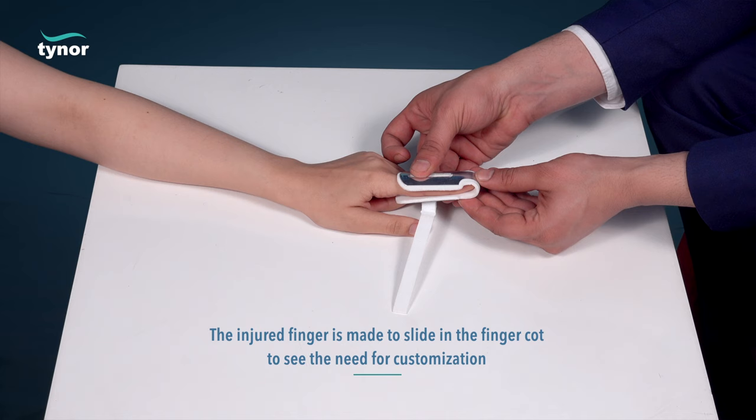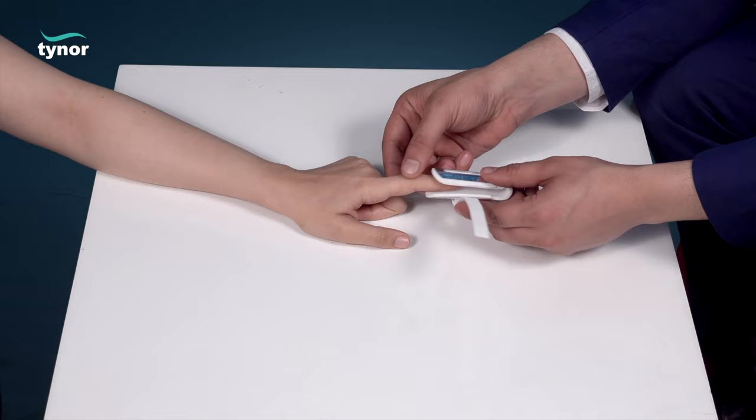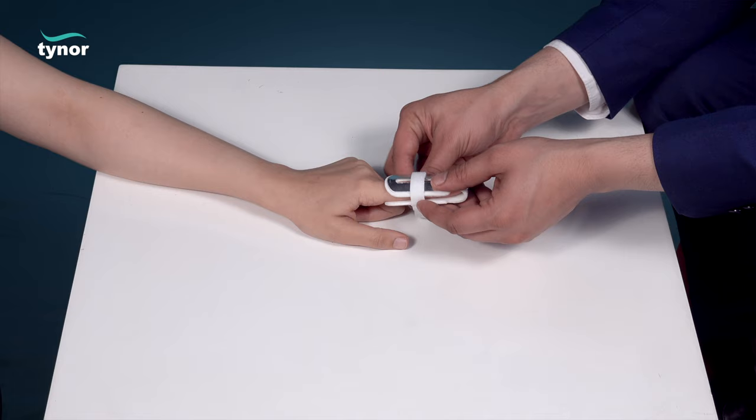To see the need for customization, the finger card is removed and then cut or bent as per the need. Then again slide the injured finger into the finger card. Now fasten the tape into a comfortable tight position.